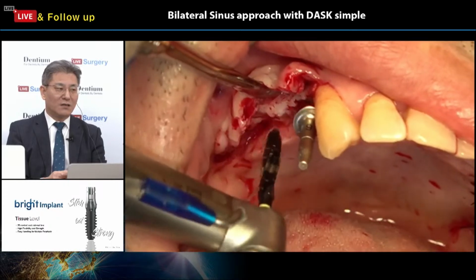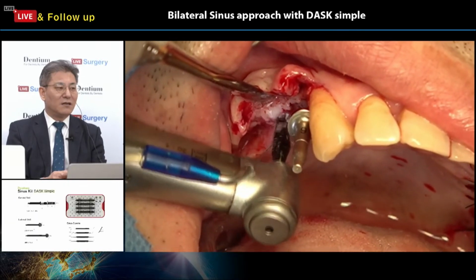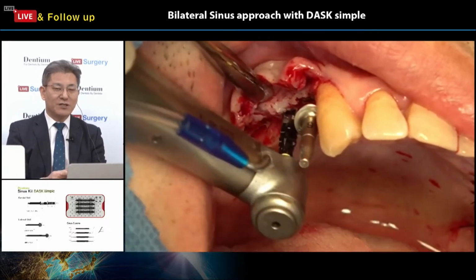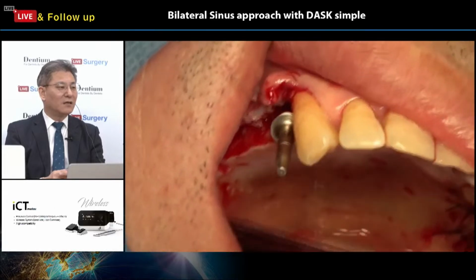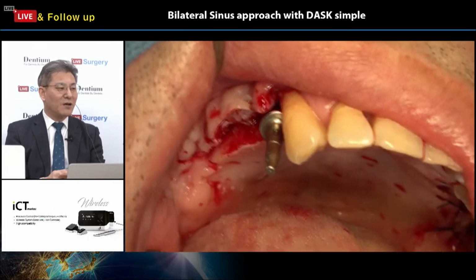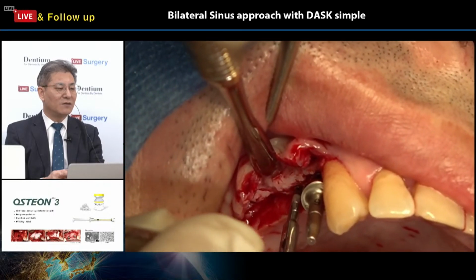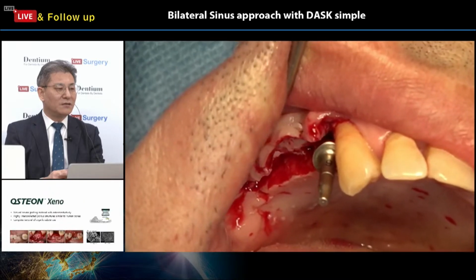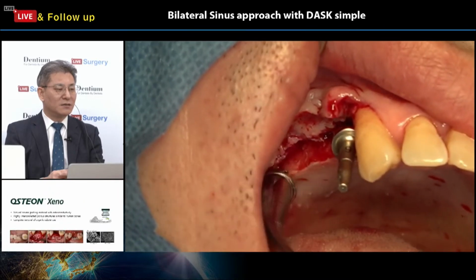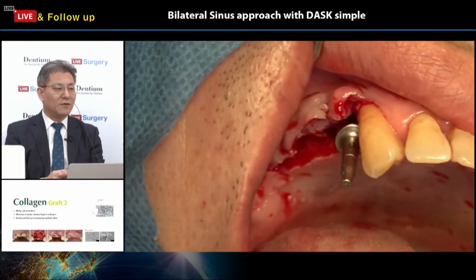We can estimate the diameter of the final drill. Okay, I think a 4.0 diameter, 9 millimeter implant will be inserted around this area, and checking the sinus prober. Yeah, we have decided 9 millimeter, 4.0.